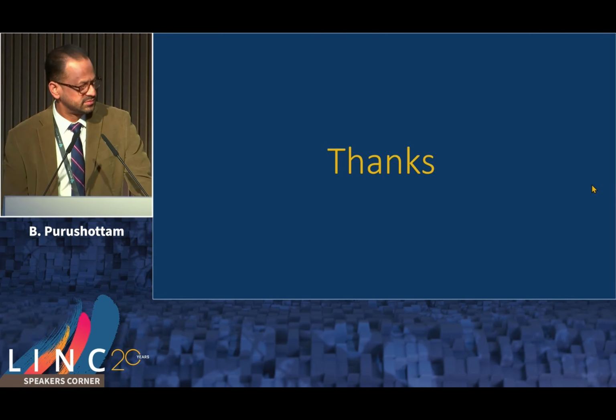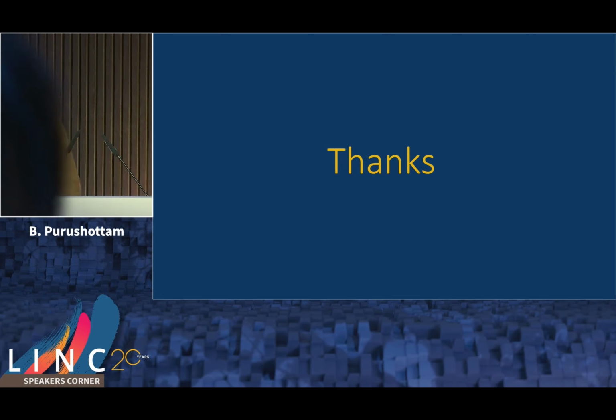Thank you very much. I would have a question. What would have been your C plan if this B plan didn't work?